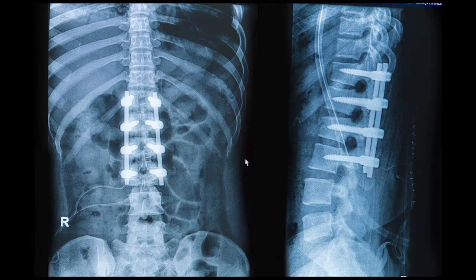So spine fusion is whenever you put pieces of the spine together? Right. There are certain patients whose spine has become unstable or degenerated over time, and we reconstruct and realign it and fuse it so it becomes one solid segment. Okay, and there's other patients on top of that that might be able to benefit from this as well, you're saying? Yes.